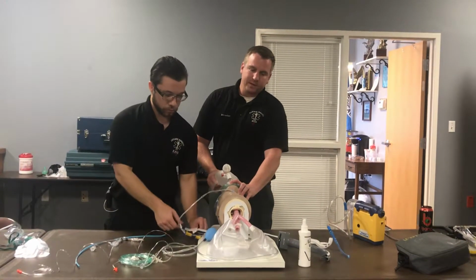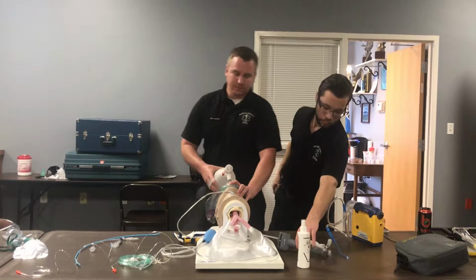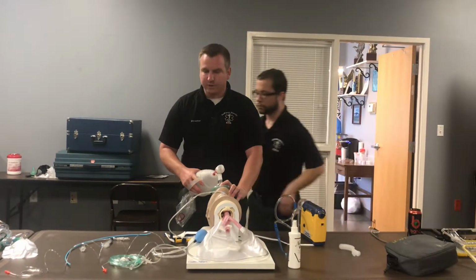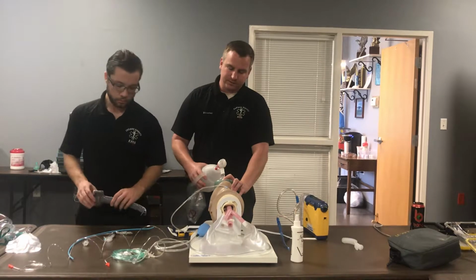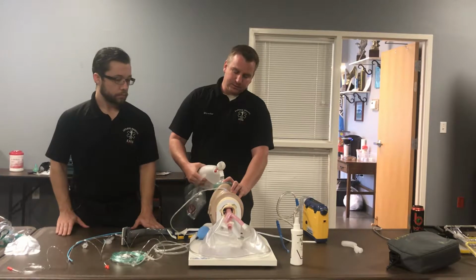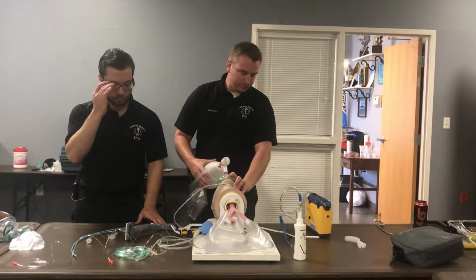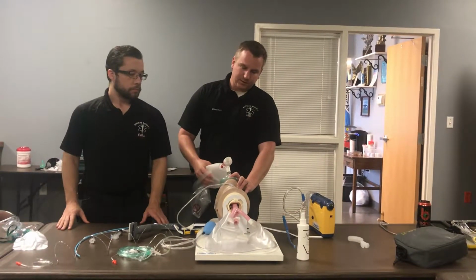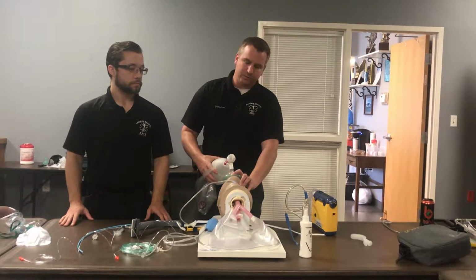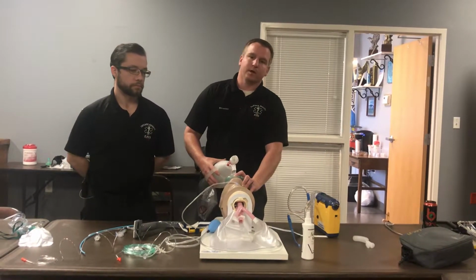So we bump that nasal cannula up to 15. It causes no damage or harm to the nares, but what it does is we are filling the patient's airway with a high concentration of oxygen because we are trying to pre-oxygenate this patient the best we can before an intubation attempt. What we want is 93% and above for a few minutes before we even attempt an intubation.